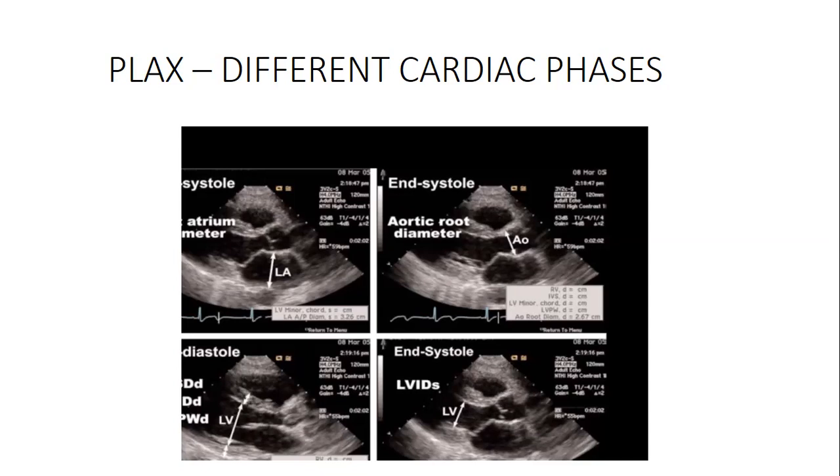So your transducer will keep releasing those pulses. The number of pulses released per second is very important in ultrasound. Why are they important? They will help you to analyze an image at a very fast rate.